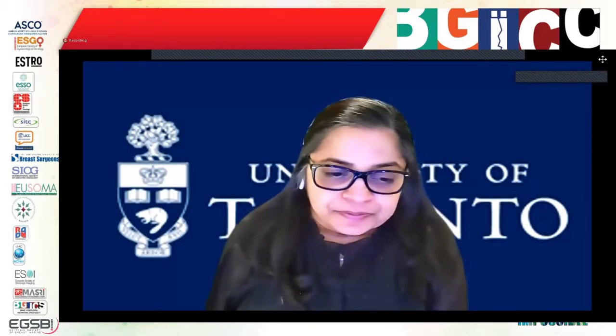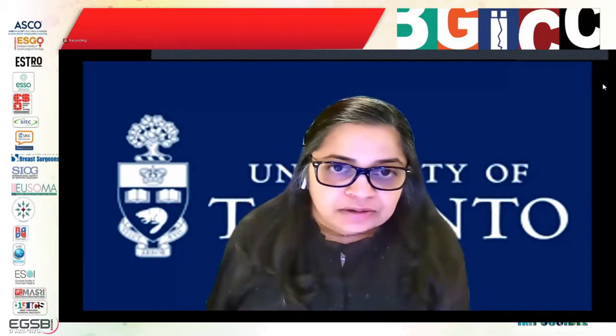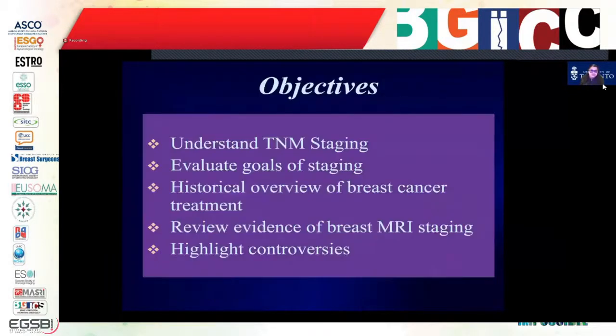So today I will be speaking about the use of breast MRI in preoperative staging, and we're going to go through this talk and discuss the appropriateness of utilization of breast MRI, as well as how we are going to use it in the preoperative staging scenario. So first of all, I have no disclosures. The objectives for today's talks are as follows.